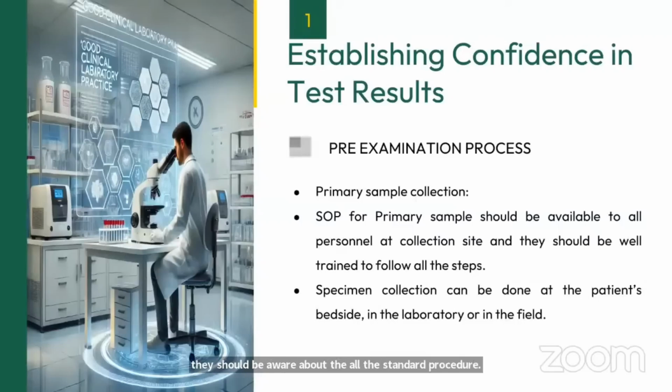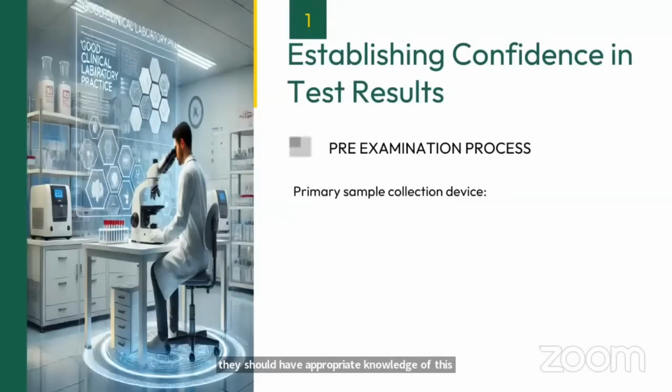Specimen collection can be done at the patient bedside, in the laboratory, or in the field. As I have mentioned, specimens can be collected either in your laboratory collection area or at the bedside, that is in the wards, ICUs, or in the field also. We have seen many times certain camps in the field or in the communities. There also specimens can be collected. So whoever is involved in the community for sample collection activities, whoever is responsible, they should have appropriate knowledge of this standard operating procedure.